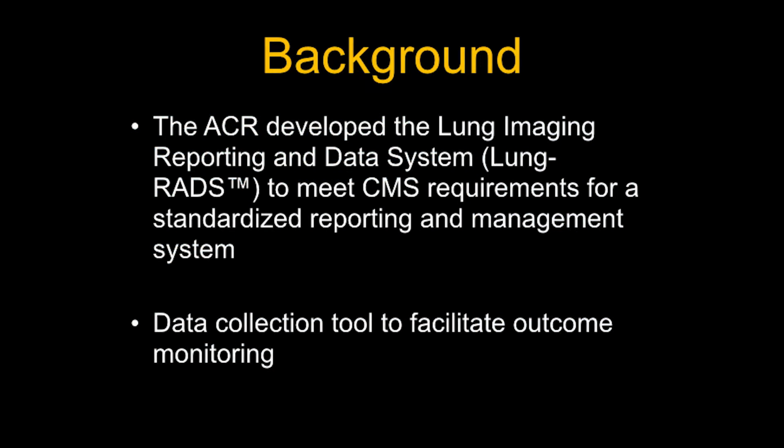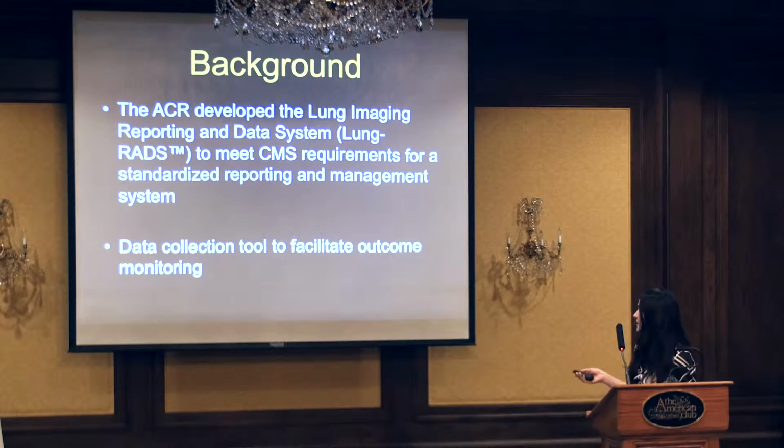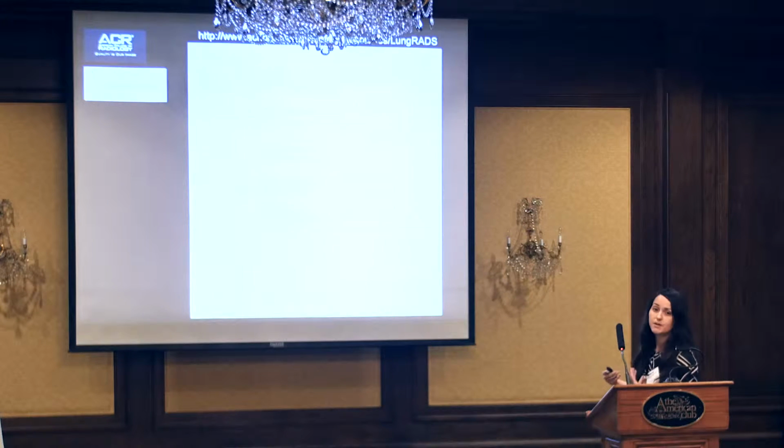I think we went already through the background, but basically Lung-RADS was developed by the ACR to meet CMS requirements, and we just want to do the same thing in a consistent manner. So it's just a way to get standardized reporting and management for all the nodules that we see. And it's a good tool because it's going to let us know in the future how we're doing, are we really benefiting the patients, and how can we improve that.